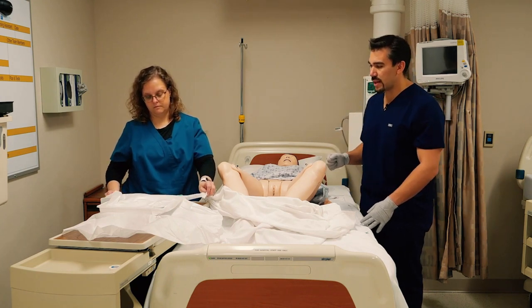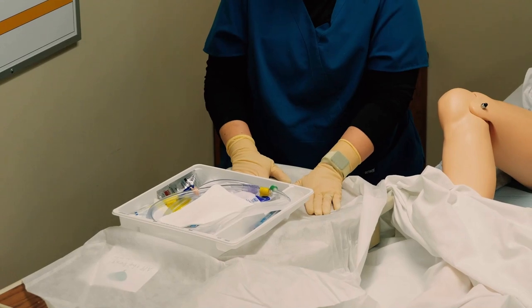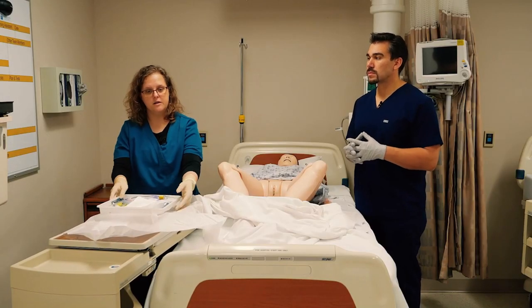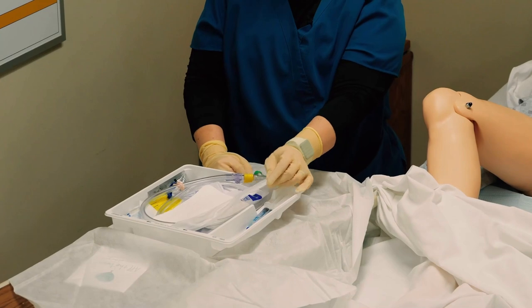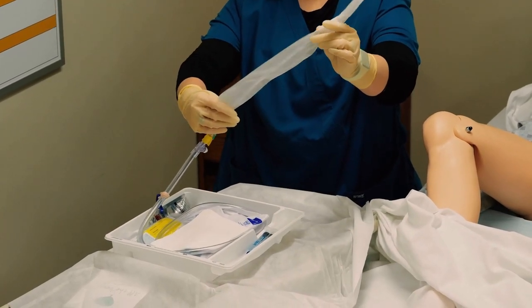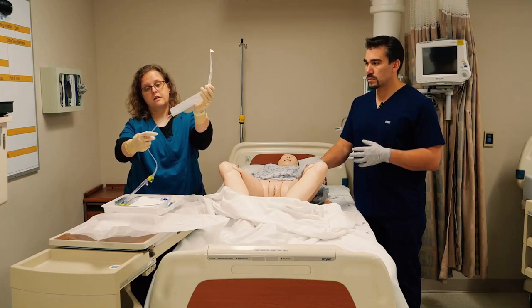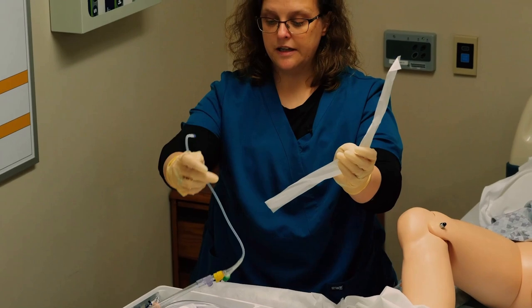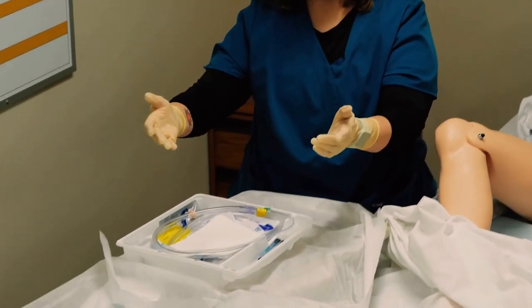Never want to walk away from your sterile kit open — always want to make sure you have eyeballs on it. Now I'm sterile and this is sterile, so I can do anything I want in this space, except reach over the top. I can't lean into it, but I can touch any of this. I'm going to take a minute and look at my kit, because the patient's not going anywhere. This catheter is covered up, and I can go ahead and take that cover off. This is the part that really has to be sterile, so I'm definitely not going to let it flop anywhere. I can drop that anywhere because everything's sterile.